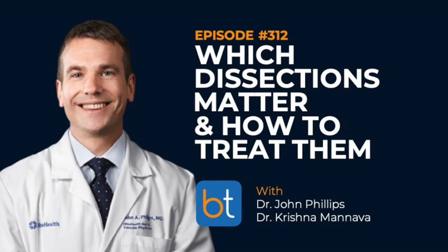And I actually just got back from the national sales training meeting for Philips, and they had me do a lot of tack stuff. Just hearing from their reps, they're having a hard time getting traction with the device for a number of reasons. Cost is one of them, but physicians are also a little unclear about where to use it. It's a pin and pull method, so it's not a triaxial thumb wheel, so it takes a little bit of finesse. And there are just a lot more questions out there.